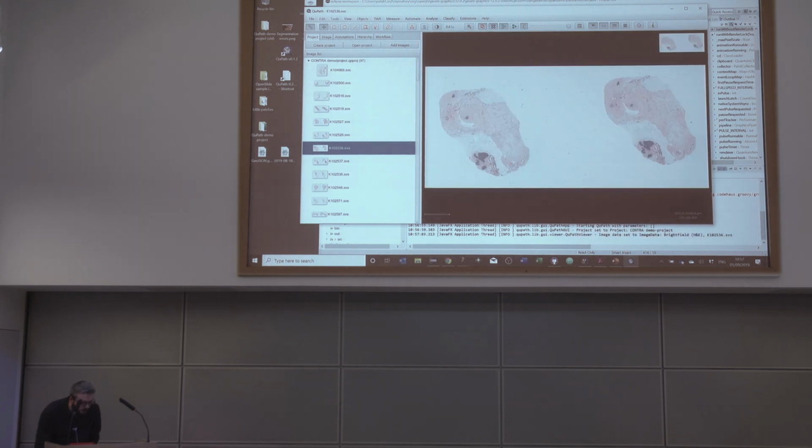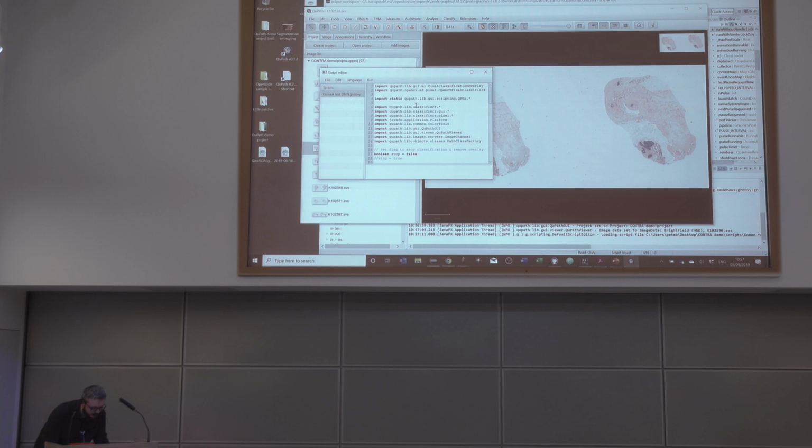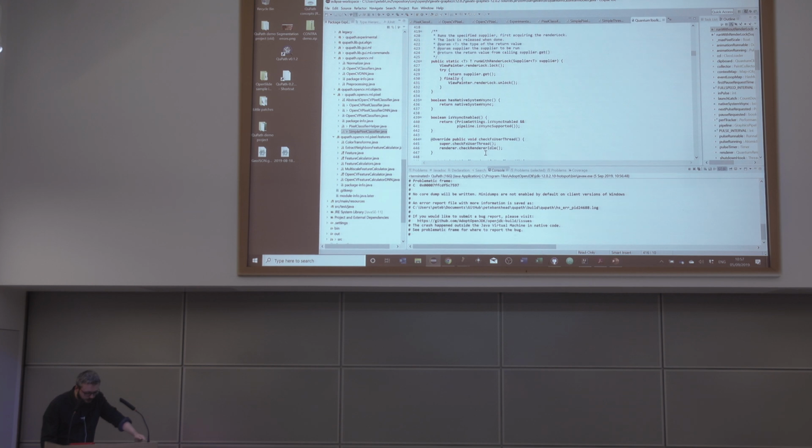It shouldn't necessarily matter. The way in which I was running this, and the way in which you can see is giving me a little bit of trouble, is using OpenCV, which can read in pre-trained models from a variety of different sources. So this one I used TensorFlow. There are some issues with making sure that your model is compatible. Yeah, it has to be something that is compatible with OpenCV.